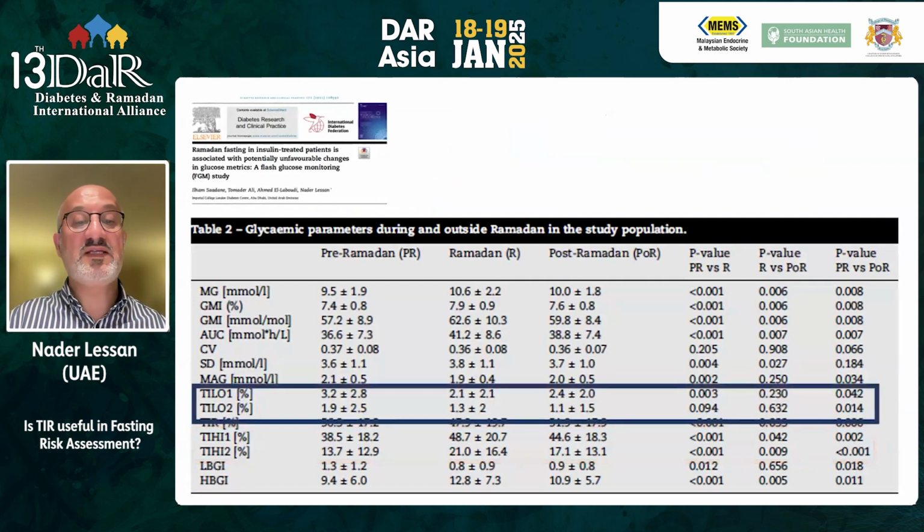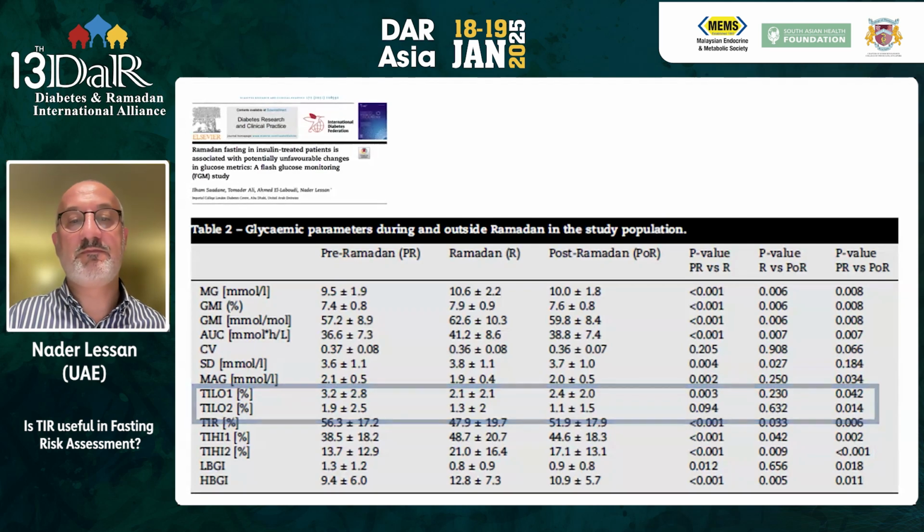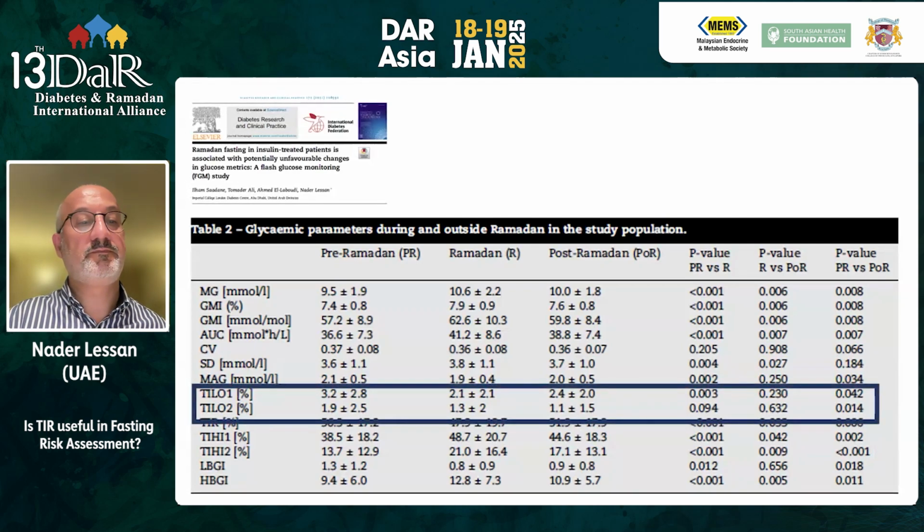What about time in hypoglycemia? Funny enough, in this particular study, what we found was that the percentage time in hypoglycemia range was actually less in the group that we studied. That is not generalizable to all other populations who practice Ramadan fasting. We know that that is not the case, but in this particular study, in a controlled setting, time in hypoglycemia was actually less during Ramadan fasting.